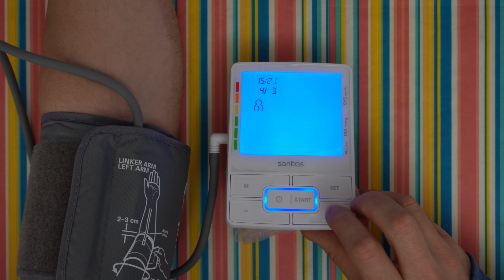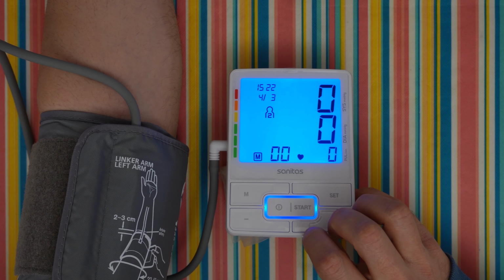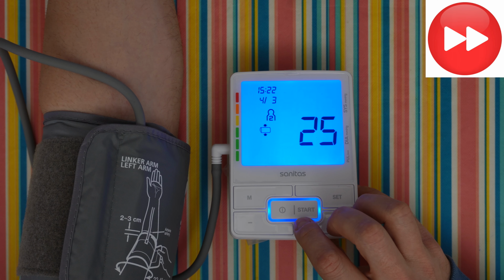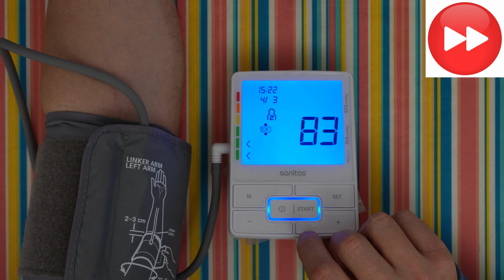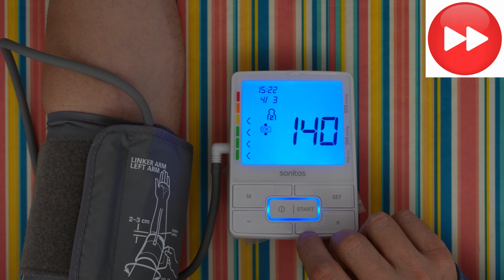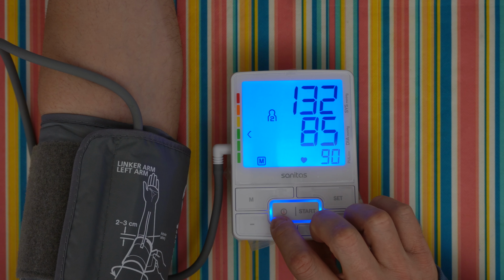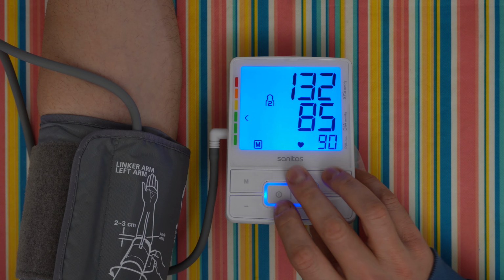On, and of course you can go to the second user and you will have measurements for the second user, maybe for your wife, second person in the family. On, we can see by pressing the memory button for the second user, we have only one value.